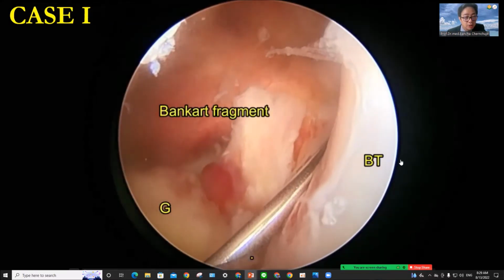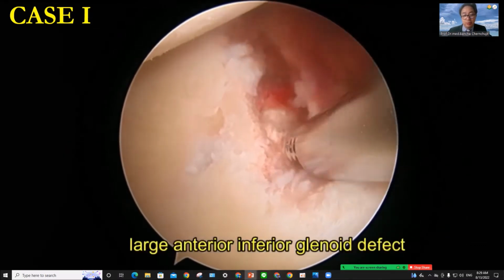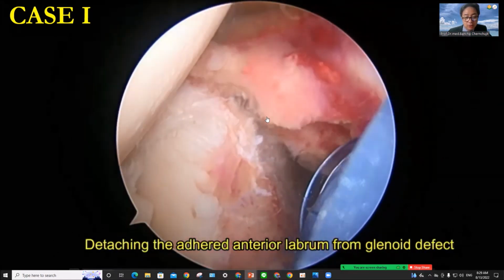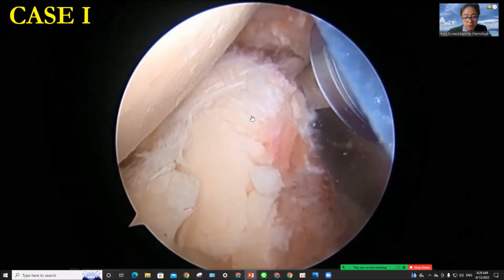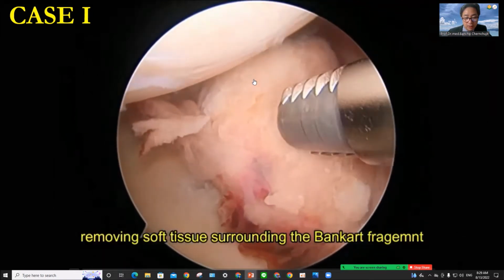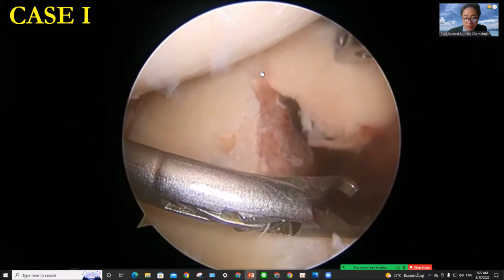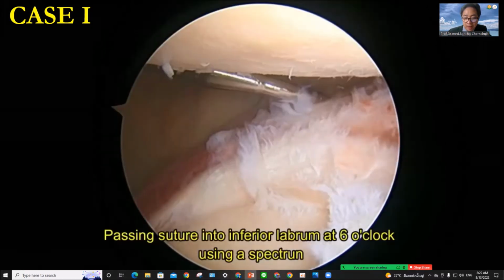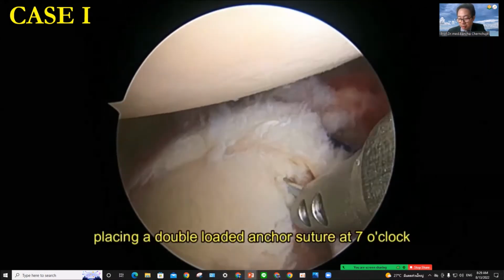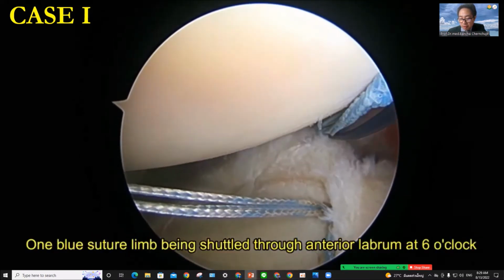Okay, so I show you the first patient. This is a patient with severe bone loss, an acute Bony Bankart. After performing the approach, the first thing is to detach. You see this one has a very comminuted fragment on the anterior part, and this fragment also rotated 90 degrees. So we need to flip this fragment. I always start my suture from the back, right? Because it's easier. You shift the inferior capsule up.